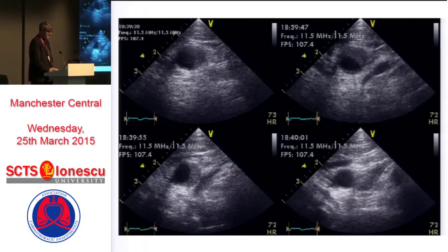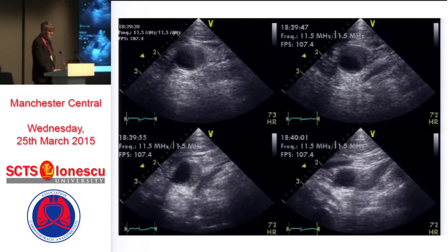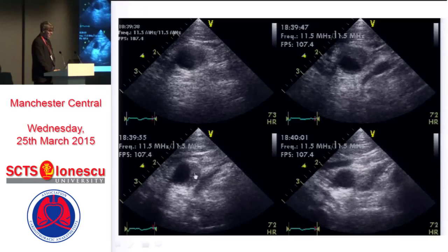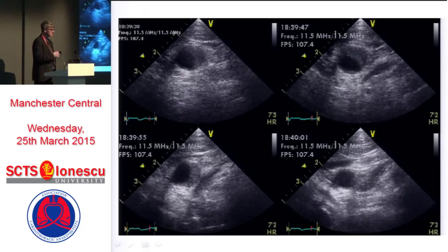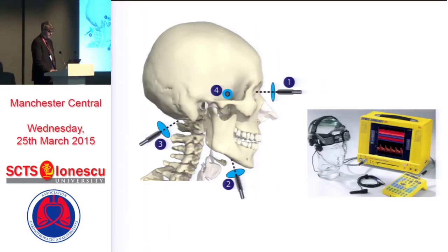Willis. And this is an example of a patient who has an aortic dissection, and what you can see is the dissection also goes up into the carotid artery. So this is an important finding that you can see with a linear probe. Transcranial Doppler can also be used. In fact, there are 4 windows that can be used.